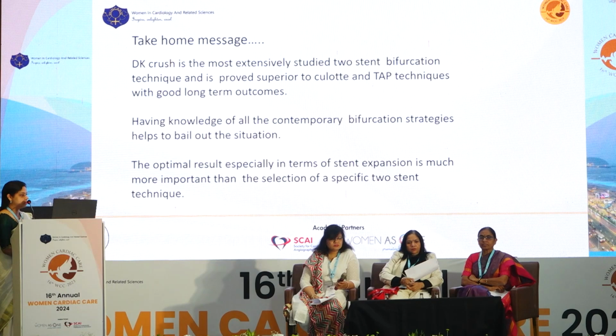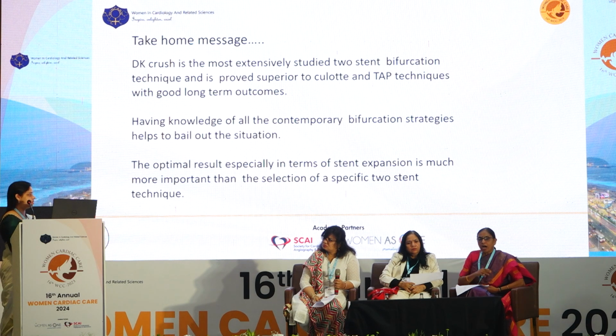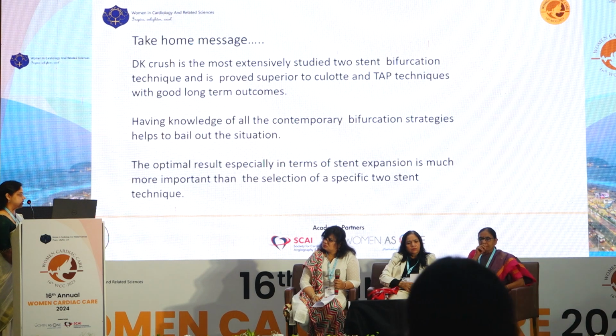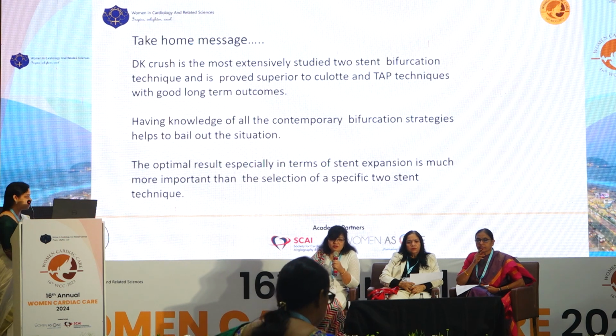DK crush, we all know, is the most extensively studied two-stent bifurcation technique, and it's proven superior to both TAP and culotte, and has good long-term outcomes. But having knowledge of all the bifurcation strategies is important to bail out any situation. And the optimal result mainly depends on good stent expansion rather than which technique we use. Thank you.